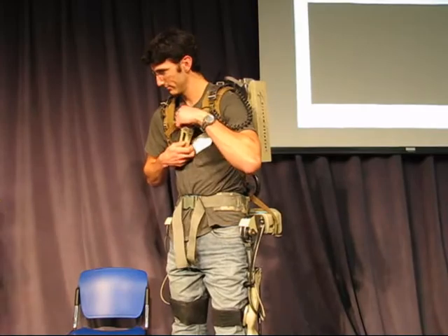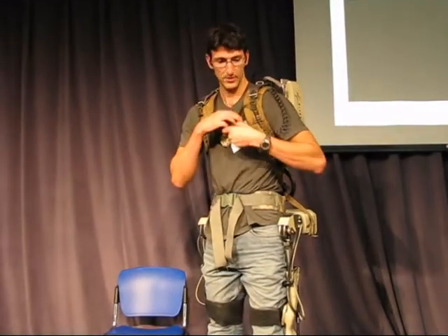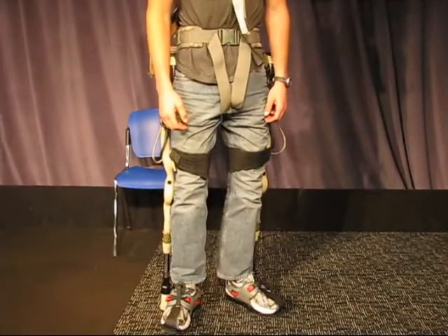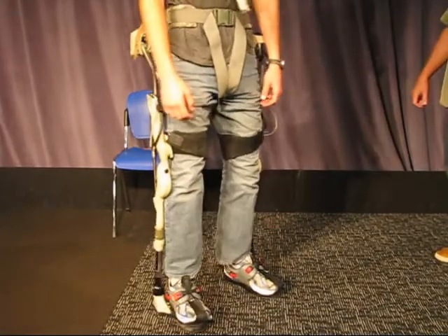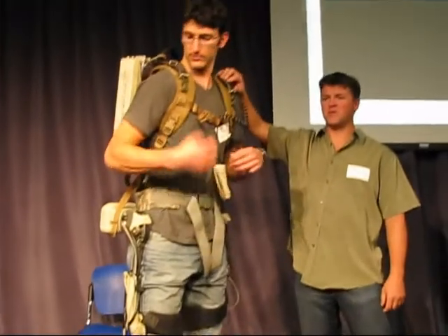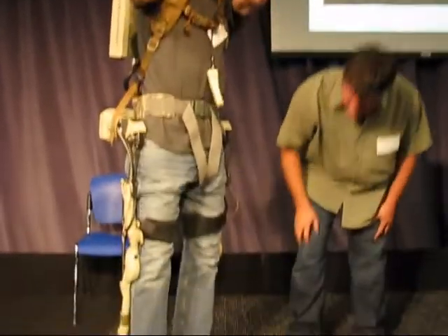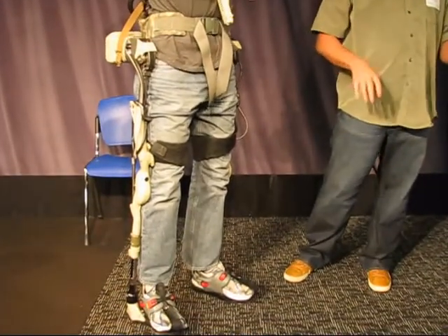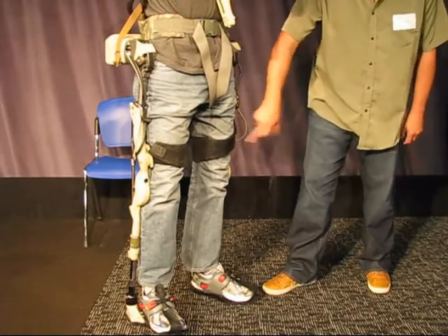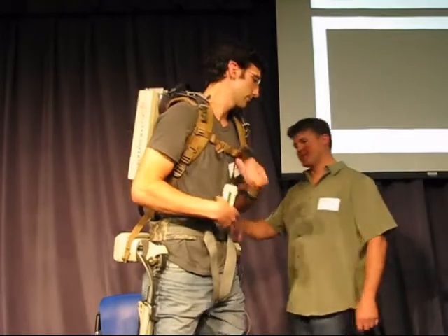Sam's at the upper range of who will fit in the exoskeleton, but it is adjustable. We have adjustability built into the shoulder straps, the torso, the thigh, and the shank. The question's about where we attach to the individual. We have attachment points at the foot. Obviously, you grab the foot in the binding, then thigh straps, a waist strap, and shoulder straps. If you turn around, I'll show them what's on the back.